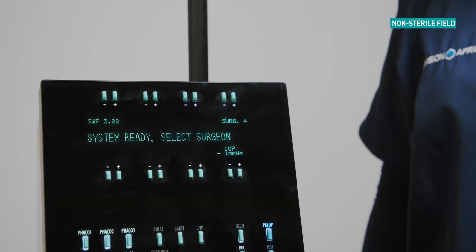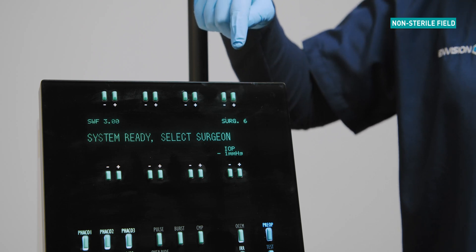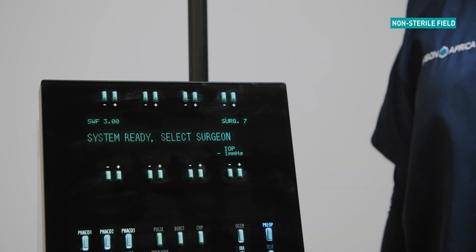From the startup screen, select the desired surgeon from the memory using the plus and minus keys on the upper right hand side of the display panel.